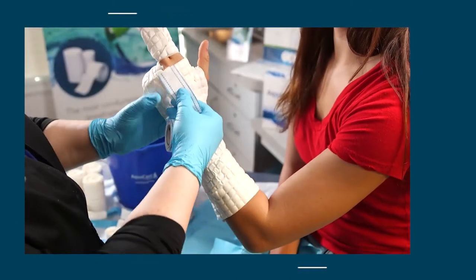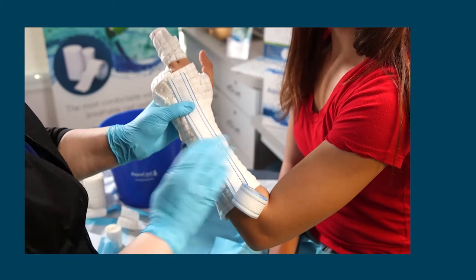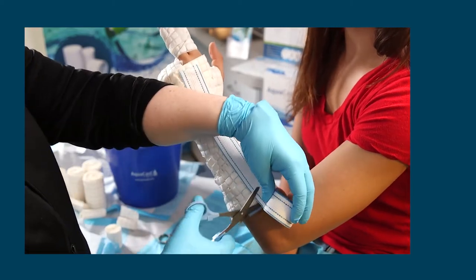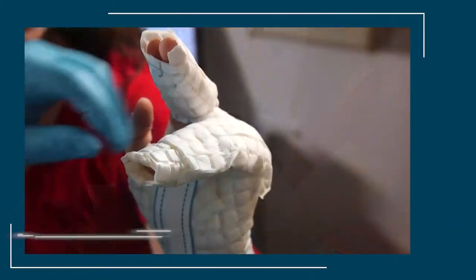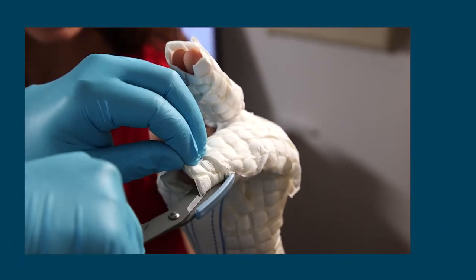Apply the saw stop strip to both sides of the cast. To open up the fingers, make two small cuts on either side.